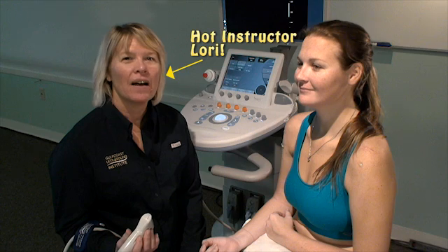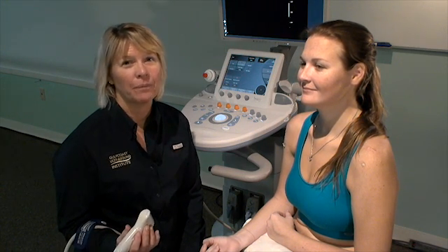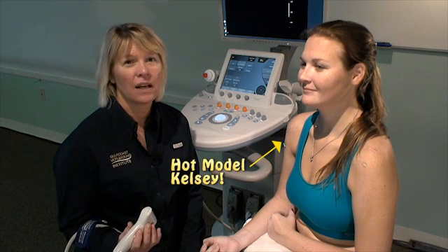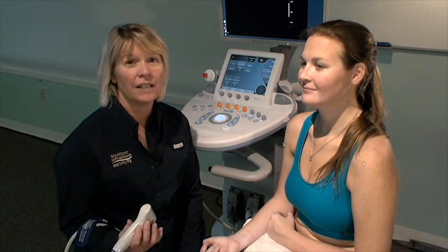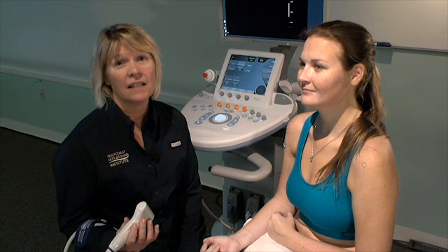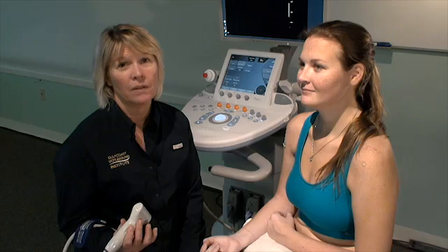Today's scanning tip is about how to identify and correct for the artifact anisotropy. Anisotropy is an artifact that occurs in musculoskeletal ultrasound imaging when the sound beam interacts with the structure at a non-perpendicular incidence. We see this most often in tendons and ligaments, but we also see it occasionally in nerves and muscles.